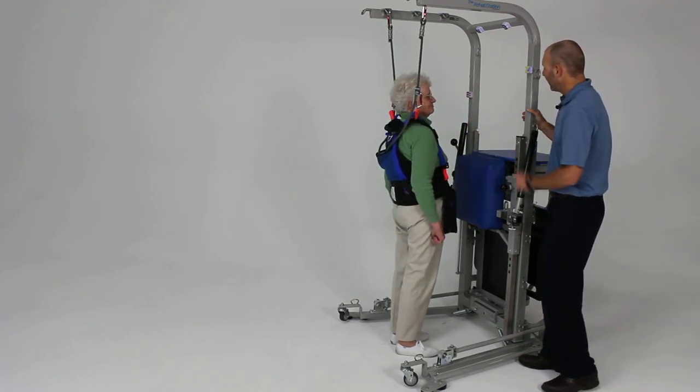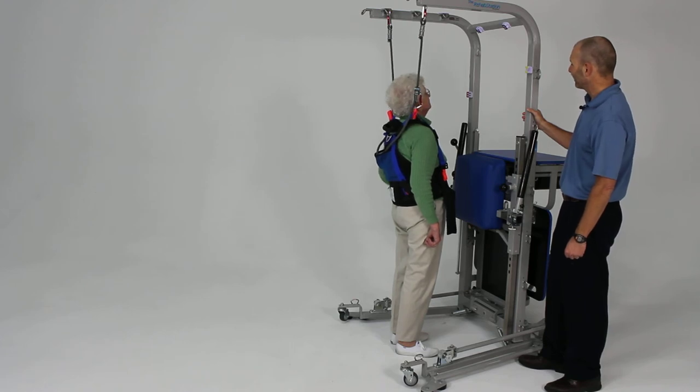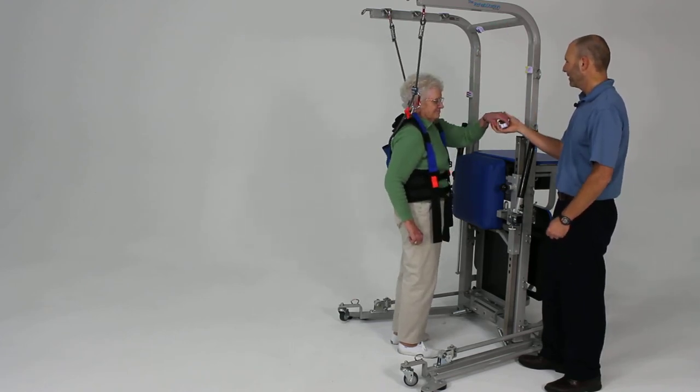Now I want you to use your left hand and see if you can reach for the B. Find the B. Excellent, good.